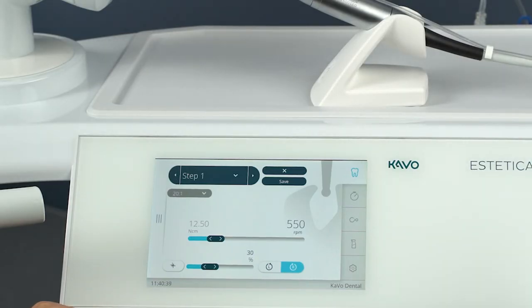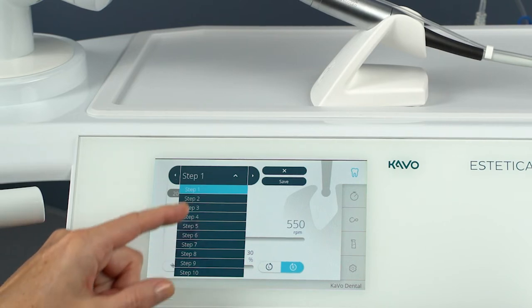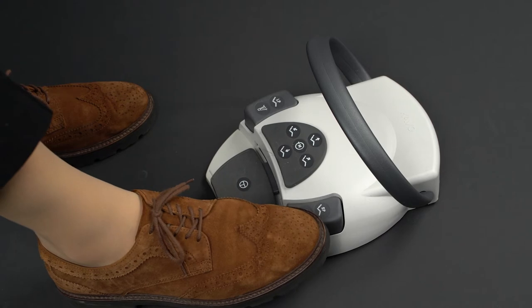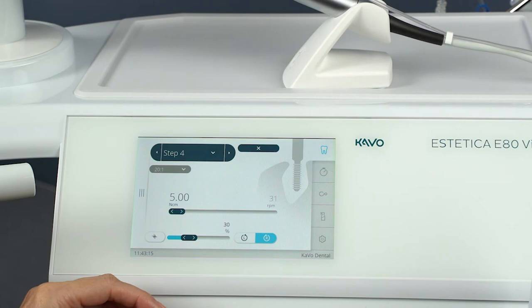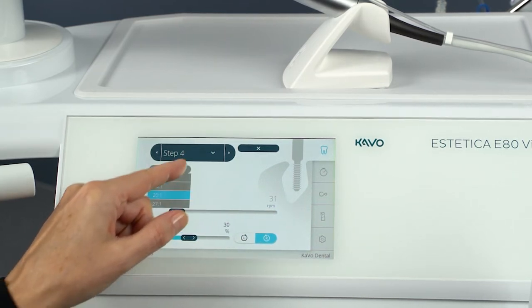A treatment sequence can consist of up to 10 program steps or activities. The treatment sequence can be designed individually by arranging the activities in any way you like. You can navigate within the sequence using the foot control so that you no longer have to touch the unit with your hand during the procedure. Depending on the application, values for the following parameters are preset for each activity: speed, torque, gear ratio, and coolant flow rate.